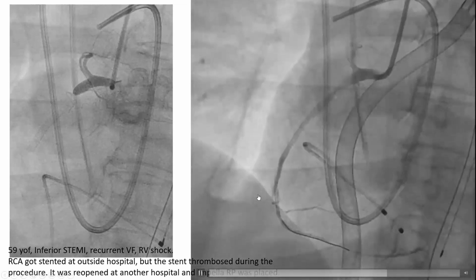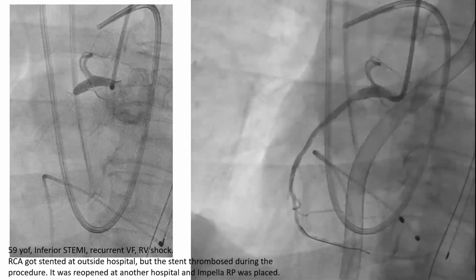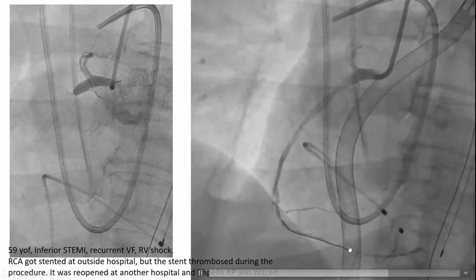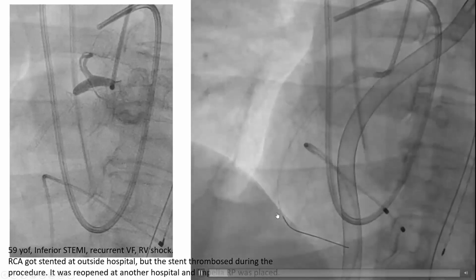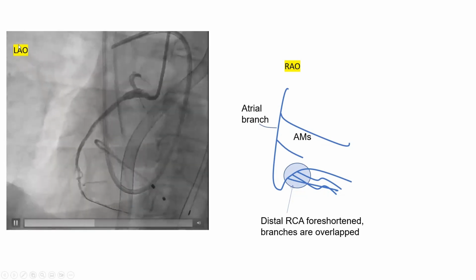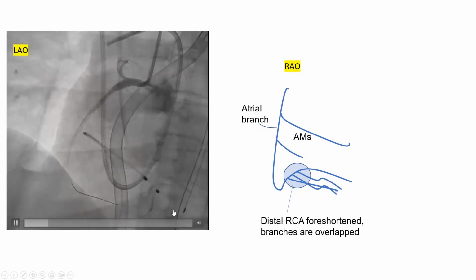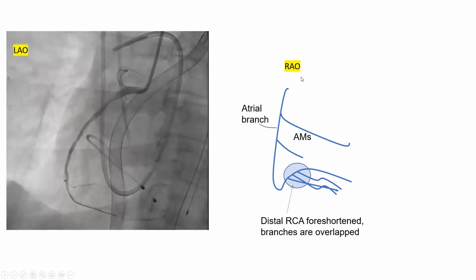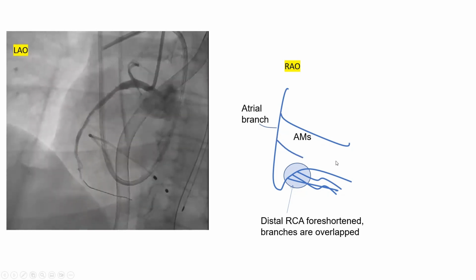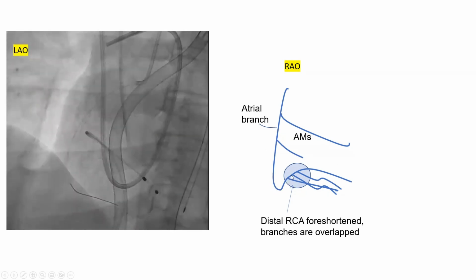One of the big reasons stents thrombose, beside underexpansion and dissections, is poor runoff. And here it's also poor recognition of anatomy. They open into one acute marginal. They miss the true runoff. And here you can do an RAO view to confirm that what you see on an LAO view as a smooth, straight structure with no bend is actually an acute marginal. On an RAO view, you'll see that acute marginal running on the margin of the right heart, whereas a true RCA will have bends distally.